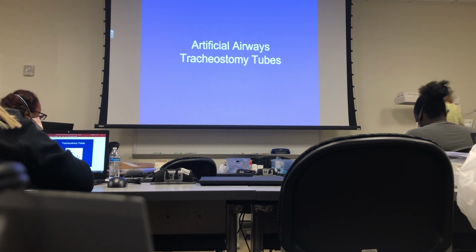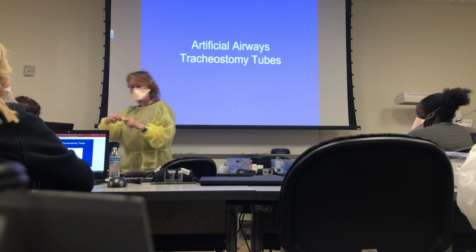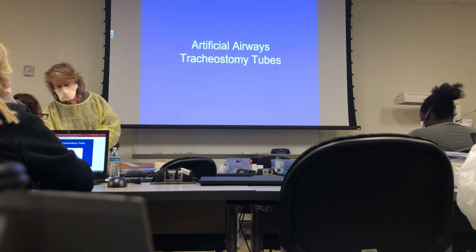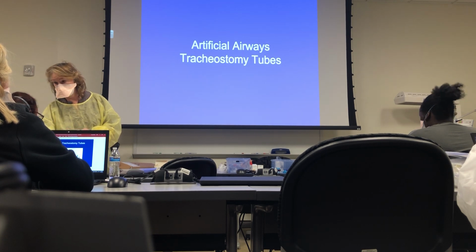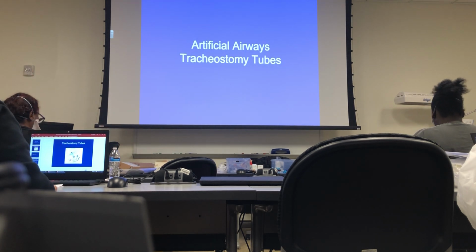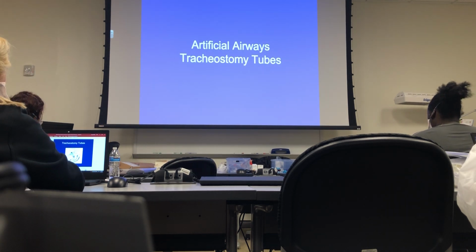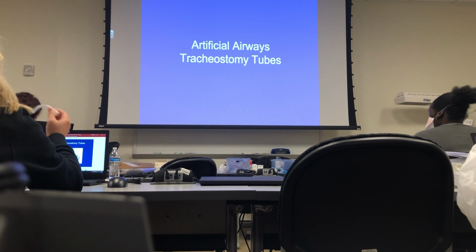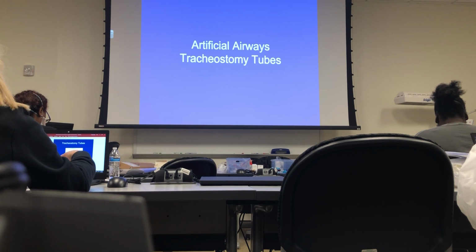Now, this is the 15 millimeter adapter that a ventilator hooks to, or a resuscitator bag, okay? Unclip, take out. Put it back in, clip so it doesn't come out, okay? Now, trachs are made up of 3 parts, which you'll likely have to identify in a picture, okay? One is the inner cannula. One is the outer cannula. And one is the obturator, okay? So, the obturator is this thing.